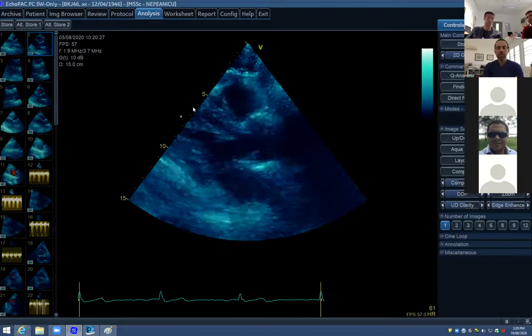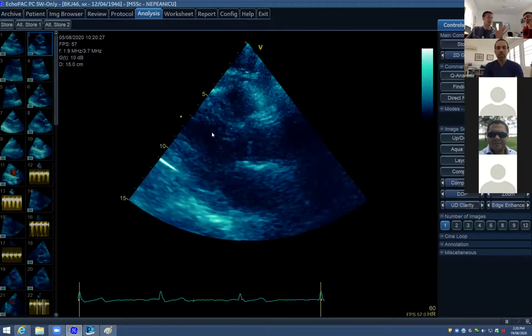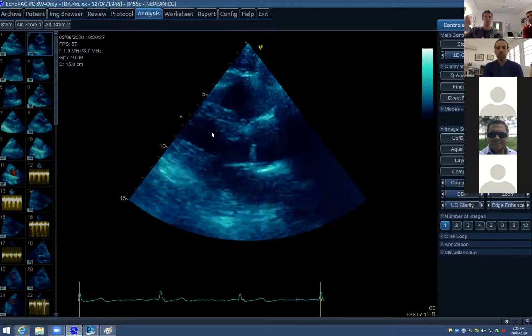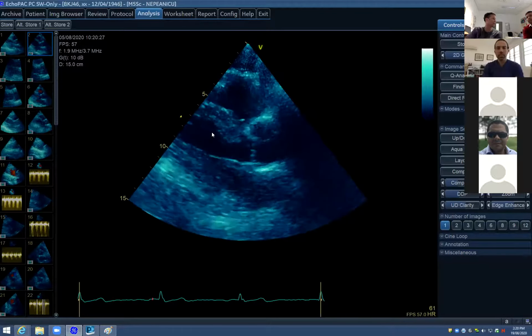So nice thought. If we think he's off axis, I think it's a little hard to say that he's hypovolemic. I think we can't say anything about his volume status if we think we're off axis. So everything else I agree with.